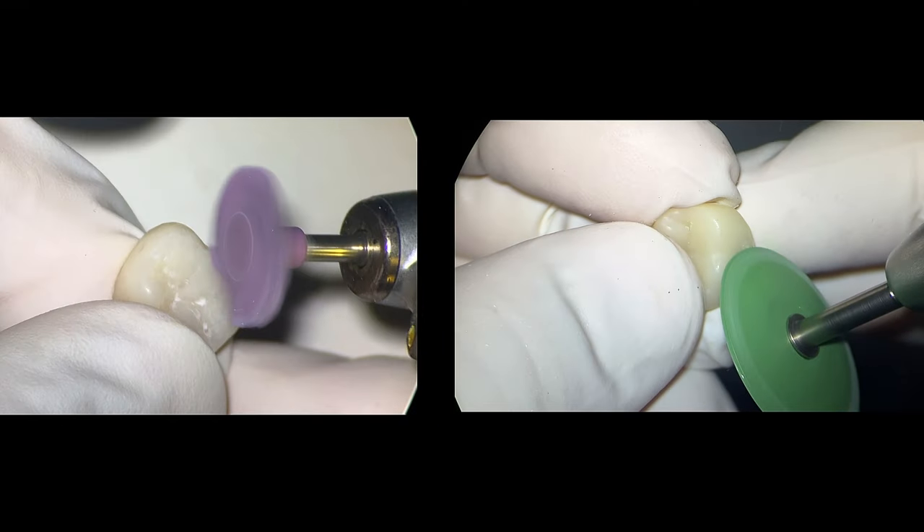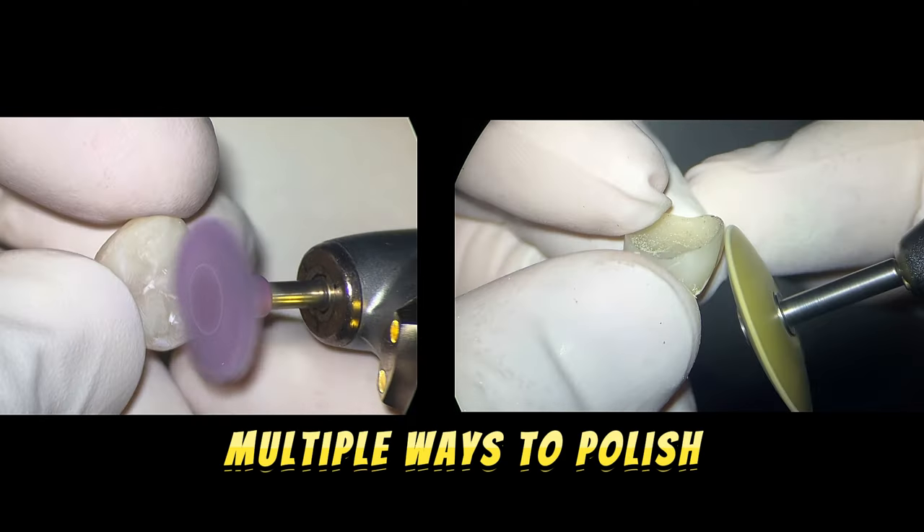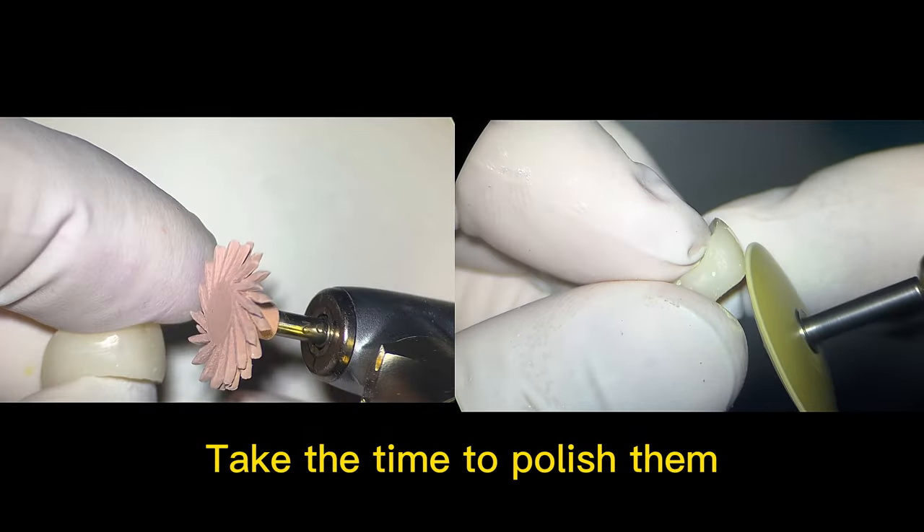Tip number ten: polishing your restoration. There are so many different ways to polish temp crowns. All I want to say is take the time to polish them, as your patient will appreciate it.